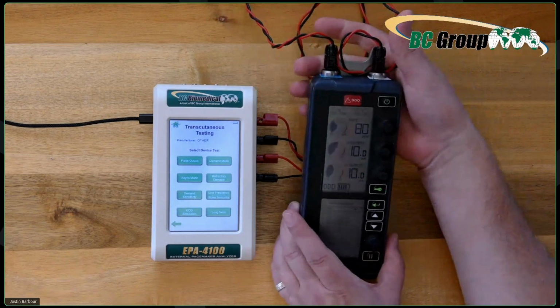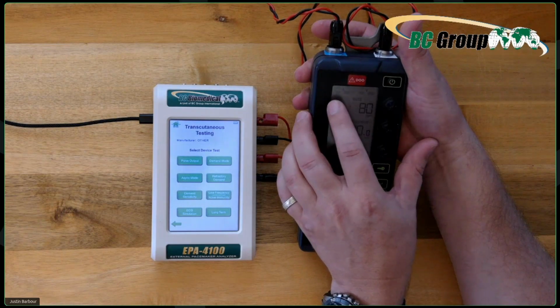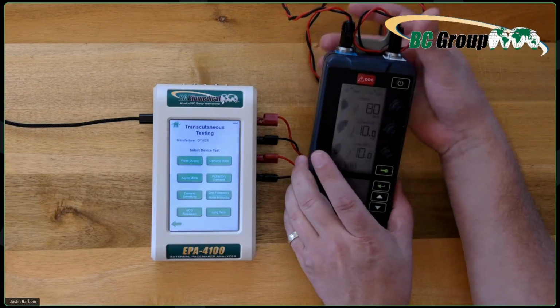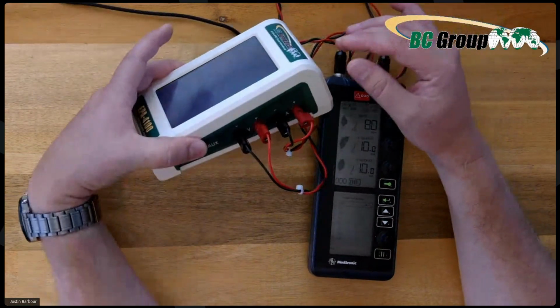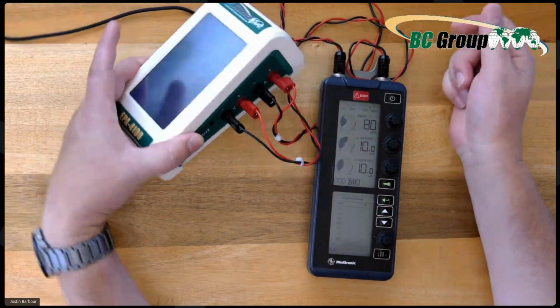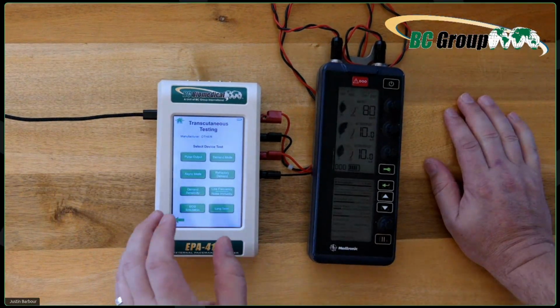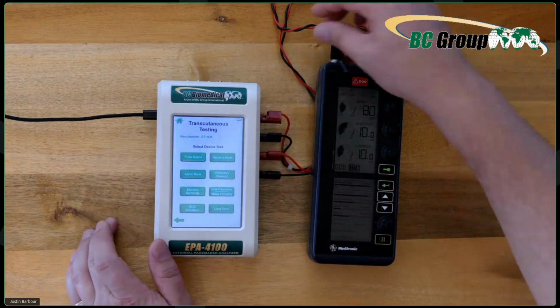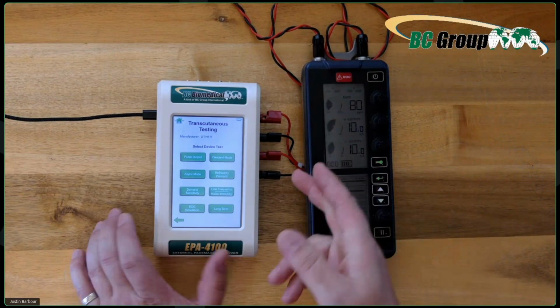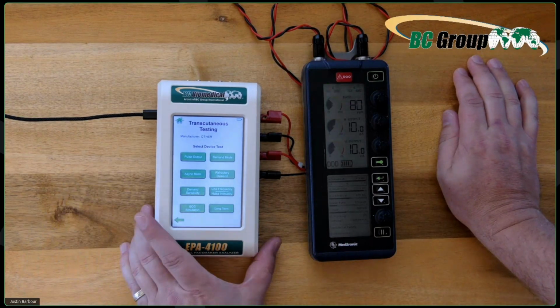At the top of the pacemaker, you're going to see that we have atrial and ventricle indicators, and we have pace and sense. There's two different lights. So sense is going to be a blue light, pace is going to be green. Likewise, over here by A and V, you're going to have LED indicators showing when the analyzer is receiving a pulse. And that's going to help you because we always question things like whether or not our cables are correct. Well, if I see that I got a green pulse here and I'm receiving it over here on this side, then you know your cables are good and your device is ready to go.